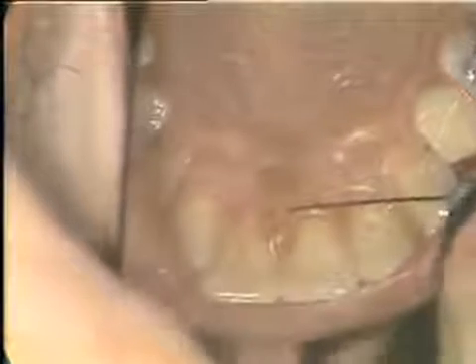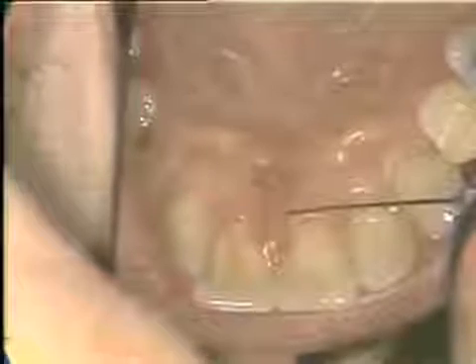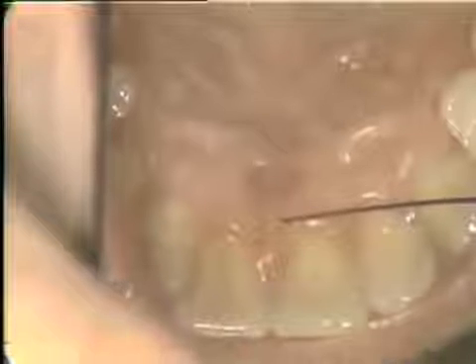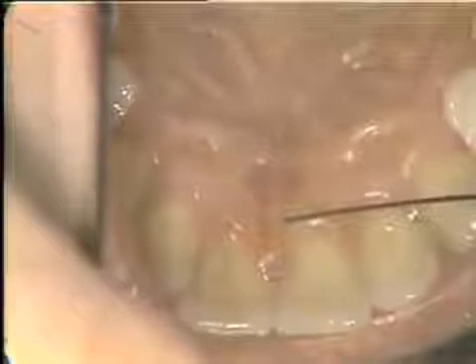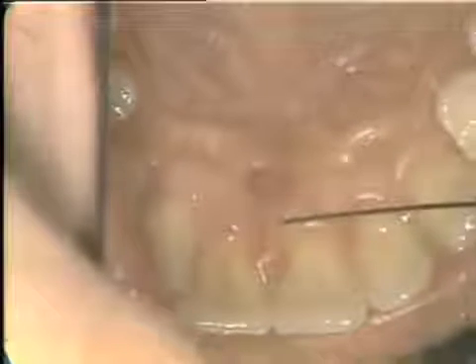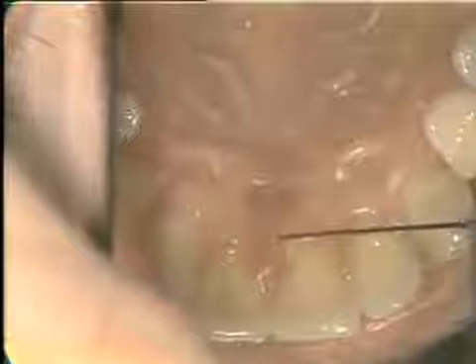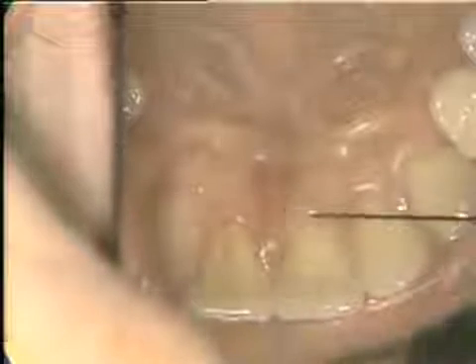All right, we have got our needle bevel against bone, and I have aspirated. And now I think as you see as we depress the plunger, you can see the papillae blanch and the adjacent surrounding soft tissue. So we know that we're getting solution out into the area of the incisive foramen to block the nasopalatine nerve.